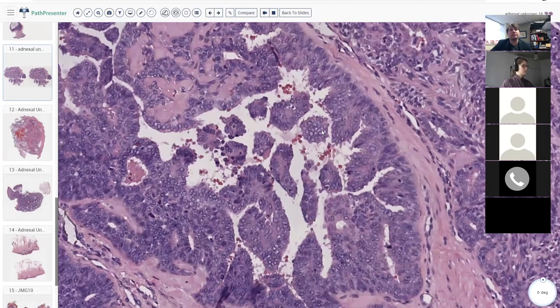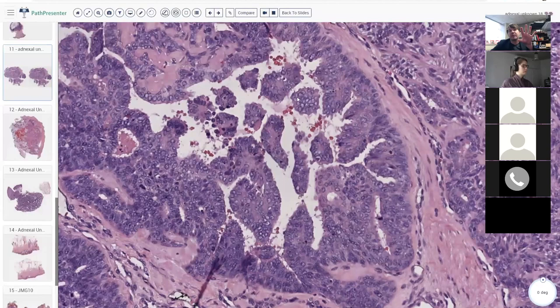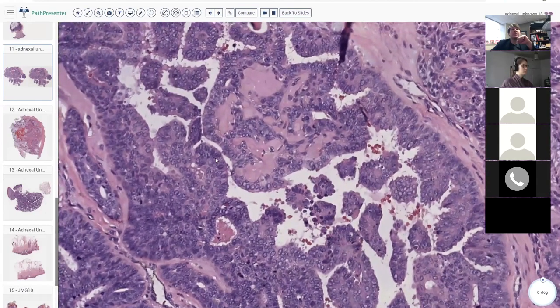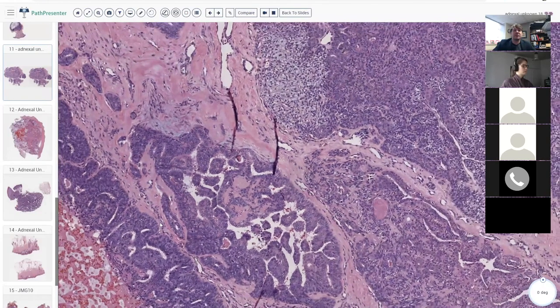What kind of structure are we looking at here? Anyone? You can type in — papilla. Yes, when you have little finger-like projections, or micropapillae technically, because we don't see the little fibrovascular cores here. These little floating islands are papillae or micropapillae where the tips are cut off and floating in space. We can see the connection in some areas but not others — it's just a matter of tangential sectioning.